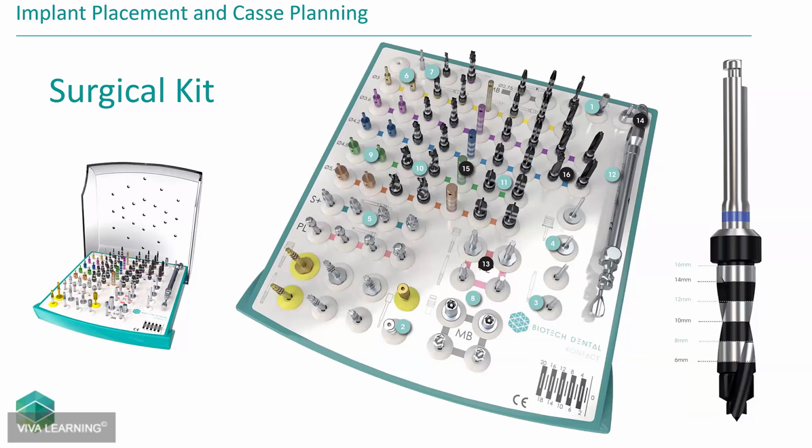Okay, so we're going to go into the basics of implant fundamentals here. This is your surgical kit. This is the Biotech kit. I've used, God, probably 16, 18 systems over the last, since 2015. I'm going to show this kit here because I do think it's very streamlined. And I think as a GP, following these protocols of streamlining your procedures is very good.